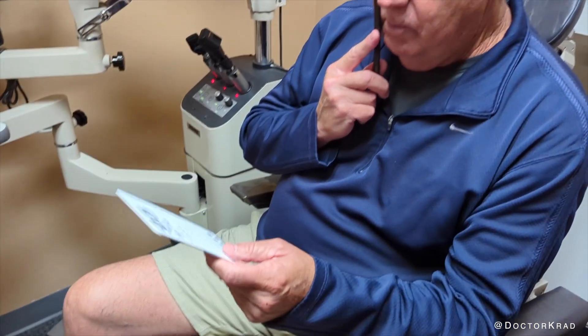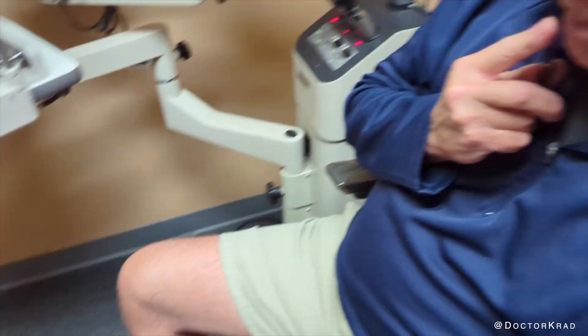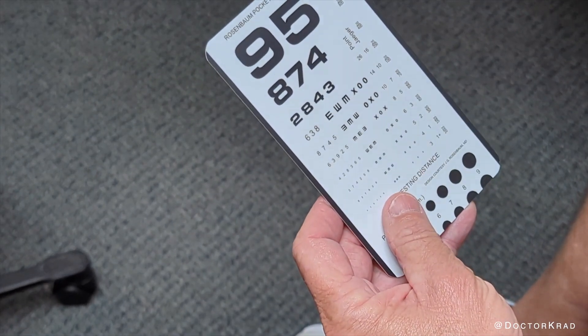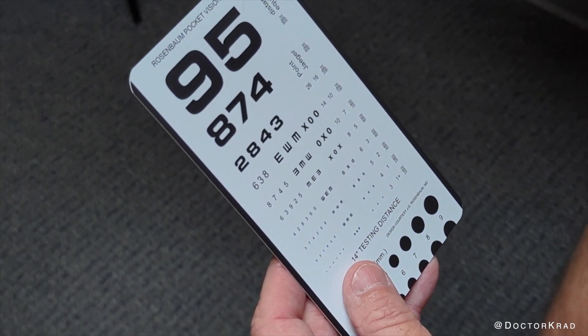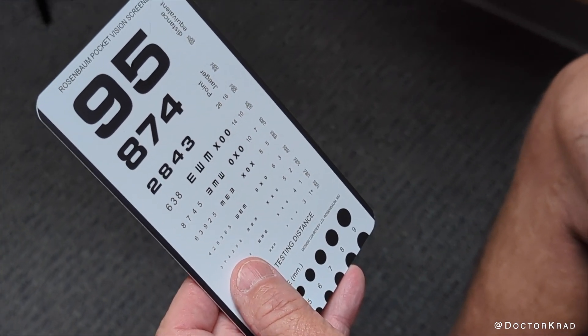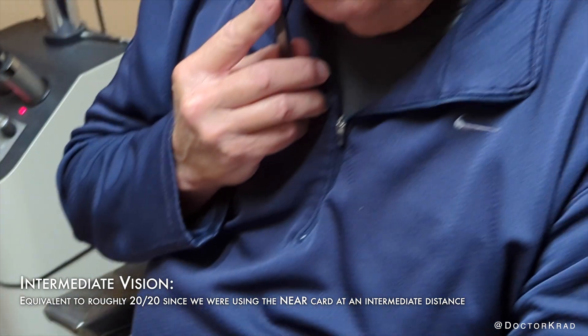Now let's try intermediate. Cover that right eye and hold that card a little bit further. Let's see how far down you can go — what's the lowest line you can read? 3-7-4-2-5-8. And that one is the J2 line. That is really good. That's really impressive. Fantastic.